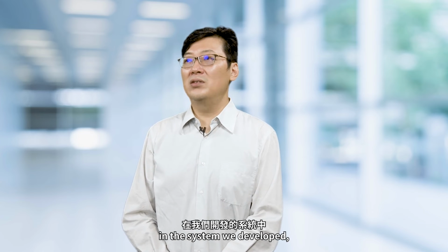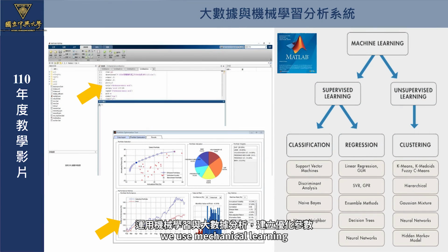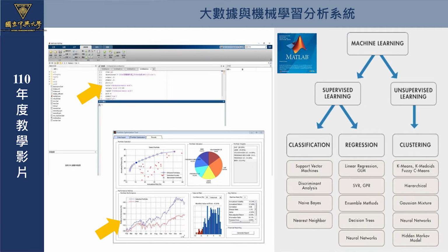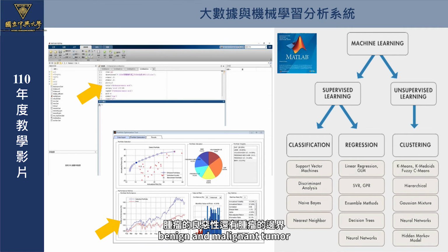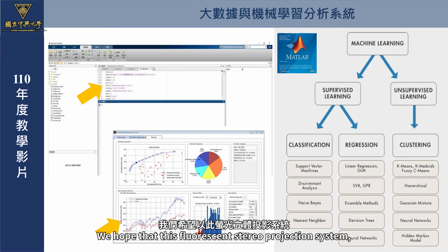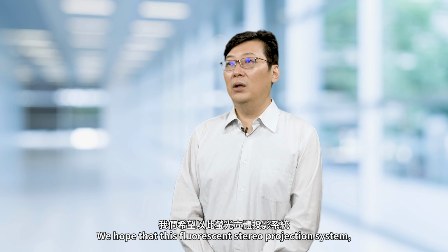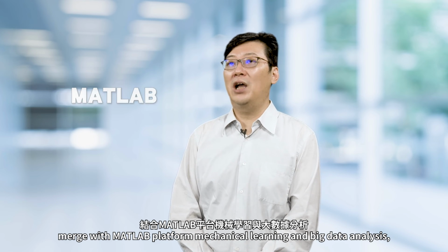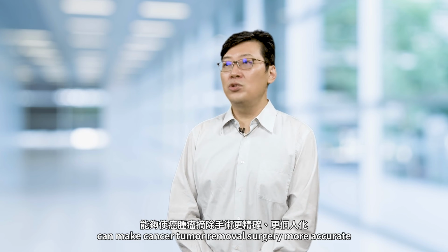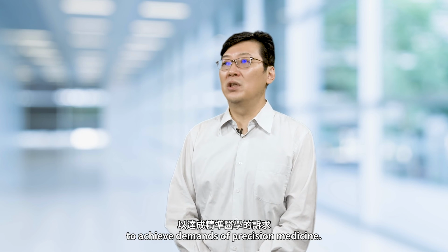However, in the system we developed, we use machine learning and big data analysis to establish optimization parameters. We can use this fluorescence stereo projection system to allow surgeons to instantly determine benign and malignant tumor as well as the tumor boundaries during operation. We hope that this fluorescence stereo projection system, merged with MATLAB platform machine learning and big data analysis, can make cancer tumor removal surgery more accurate and personalized to achieve the demands of precision medicine.